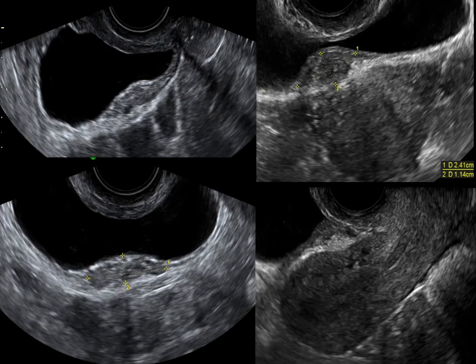The one on the left is a rather smooth fusiform lesion on the floor of the bladder, which is very typical of endometriosis. If you turn on the color on these lesions, there is some color but not much, and that's usually what we see. Now, this one looks a little bit more aggressive in that it seems to extend a little bit further in the wall here and even into the serosa of the uterus.